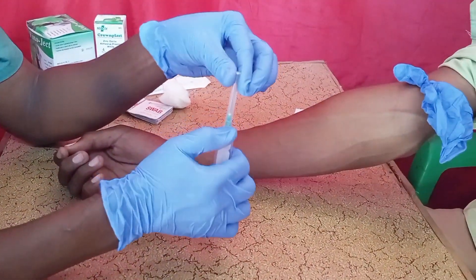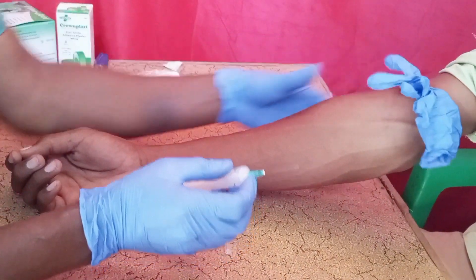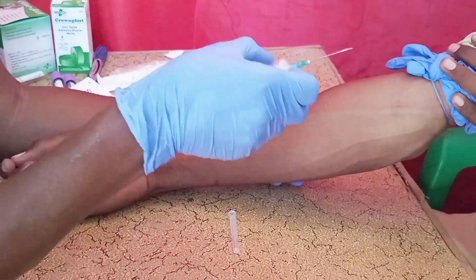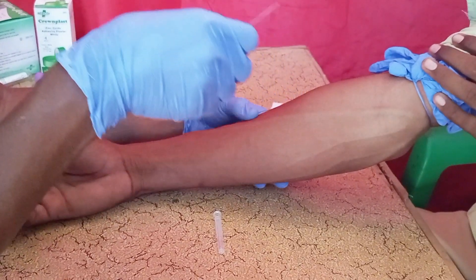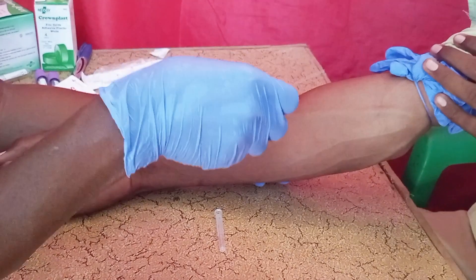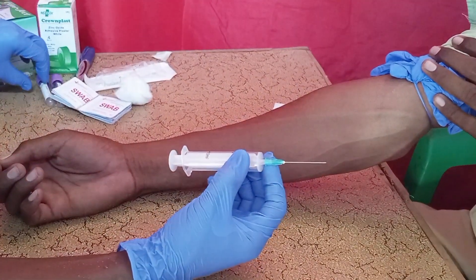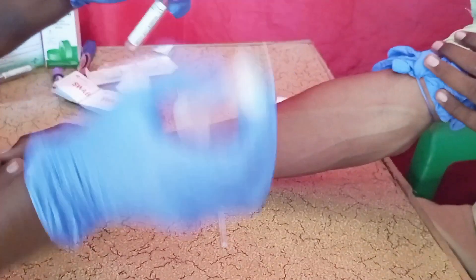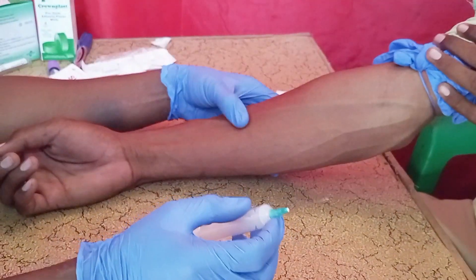This is how you are going to take the blood — please watch carefully. This is the best, simplest, and most effective and safest way of drawing blood from a vein. Make sure you prepare your blood collection tube so that you are able to transfer the blood into it.